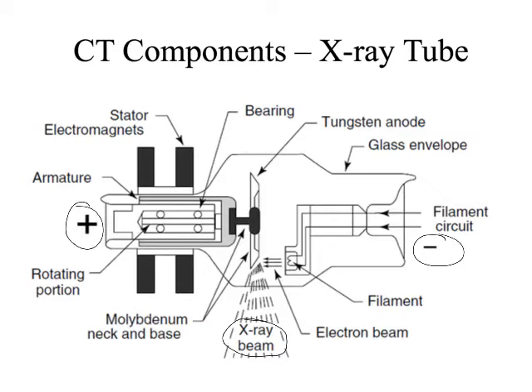All right, the other thing I want to point out about what happens inside the tube that's significant to us in X-ray is I pointed out that it's really, really heavy. The reason that it's really, really heavy is because it's encased in lead. The reason that it's encased in lead is because when we produce these X-rays, they are produced, and here's another fancy word, isotropically. Right? Let me spell out these words because I'm not trying to lose y'all as I'm talking about this.